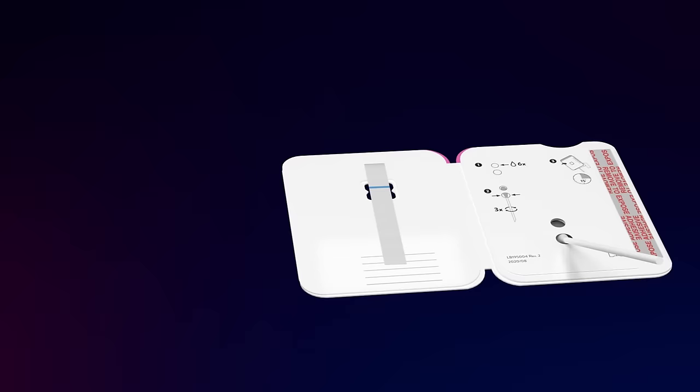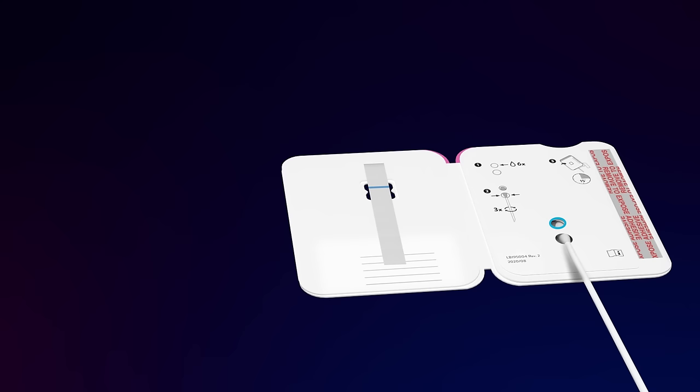Next, perform the test. Keep the card flat on the table. Insert the swab tip into the bottom hole. Firmly push the swab tip from the bottom hole until it is visible in the top hole. Do not remove the swab from the card.